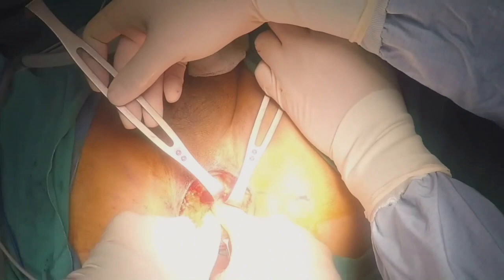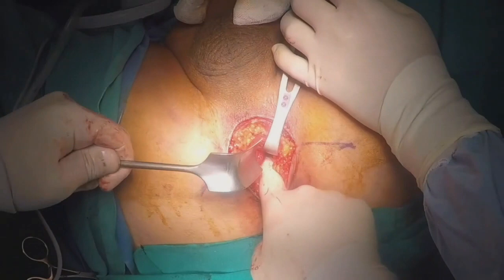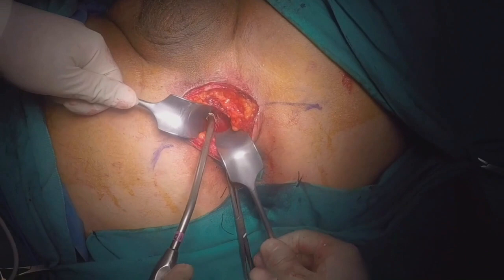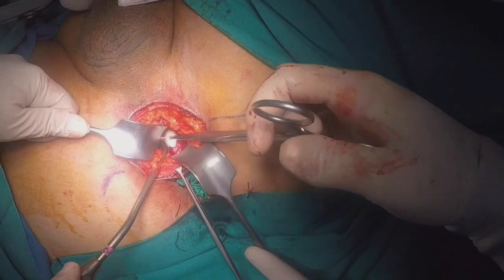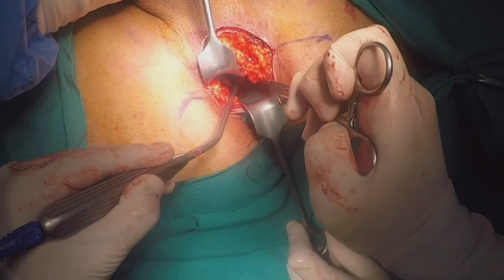Yeah, I can imagine. Now I create cavities lateral to the prostate, and now I feel the prostate apex with my finger. Then you can see the lateral prostate now. The suction, aspiration and peanut sponge. Now you can see, yes, this area is prostate. So it will be finished, the open surgery.